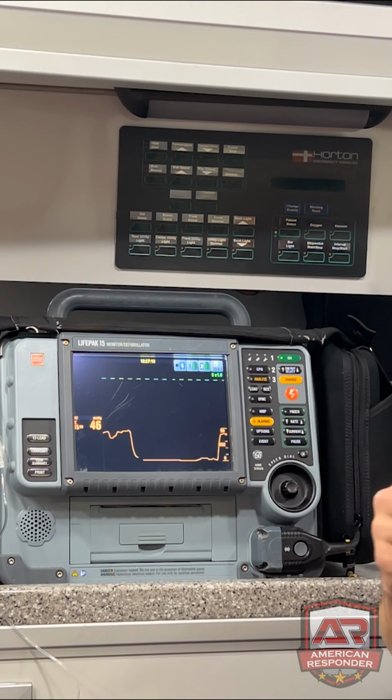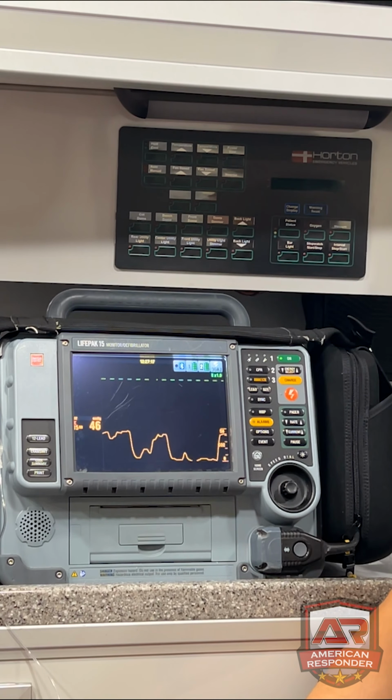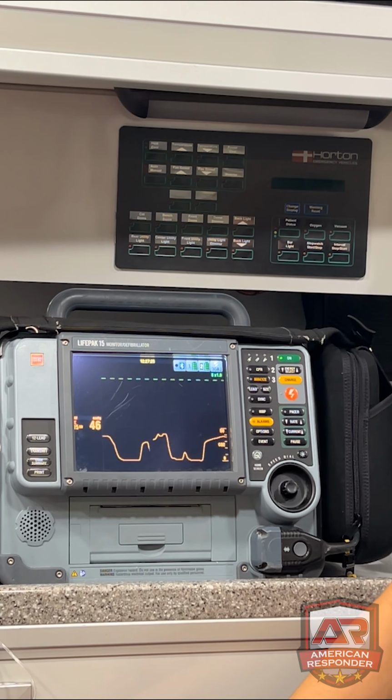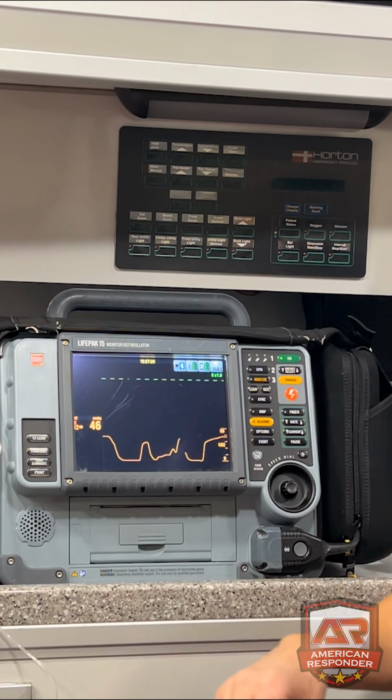As you breathe out, you get a spike. This is the most accurate real-time measure we have. Better than blood pressure, better than anything else, capno tells you in real time what's going on. When you breathe out, that's giving your carbon dioxide levels.